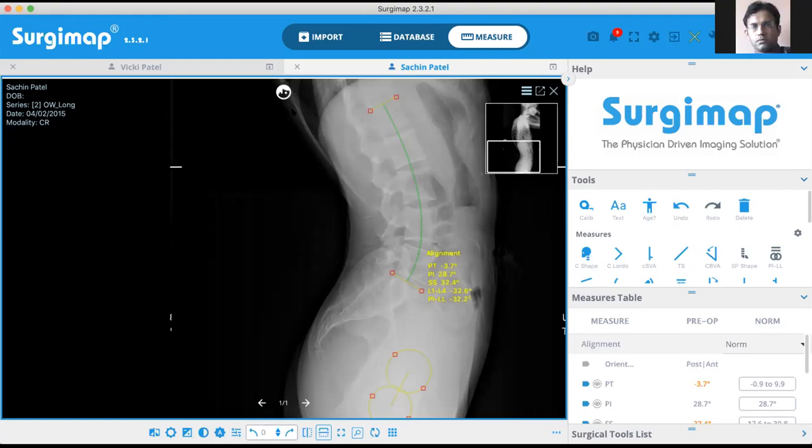It's not otherwise, like in the AP X-ray yesterday when we were playing with it, it was showing all four things: front, back, right side facing and left side facing. But today, I think it has kind of found out that we are playing with a lateral X-ray. So it's showing me either left facing or right facing. It's not showing me the other thing.